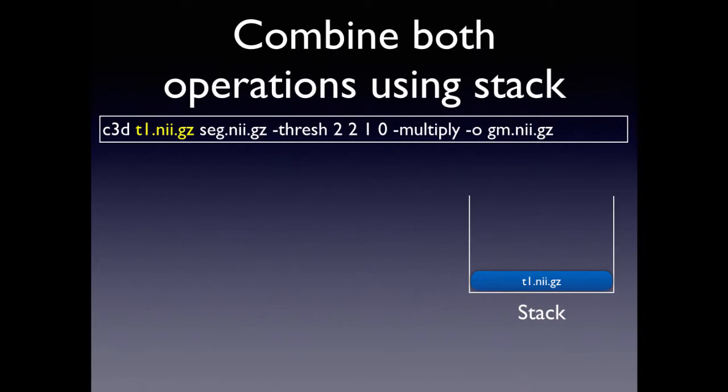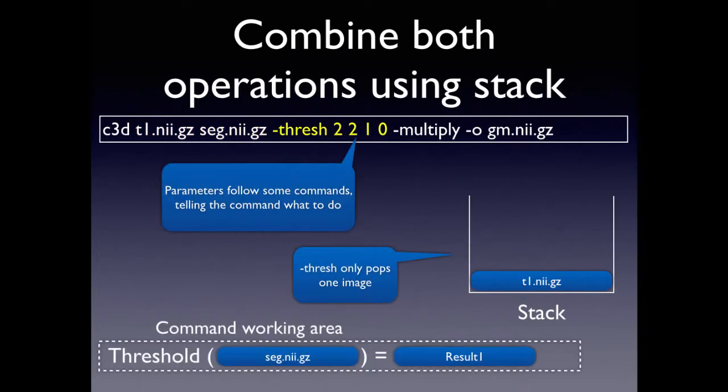So let's load the T1 and then the segmentation. And then we'll do the threshold.